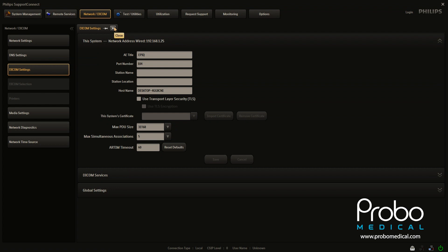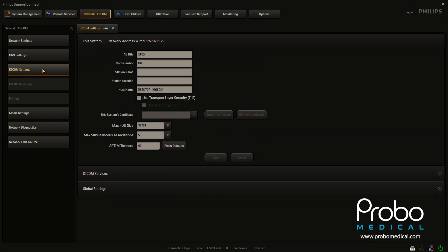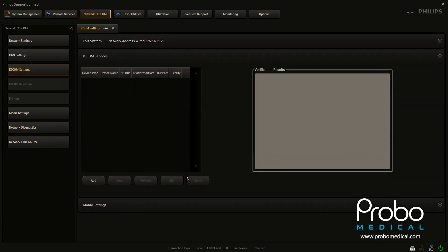So we're going to come out of that and then we're going to go back into DICOM settings and go down here to DICOM services. So this is what we're going to actually add. In this case, we're going to add a server.